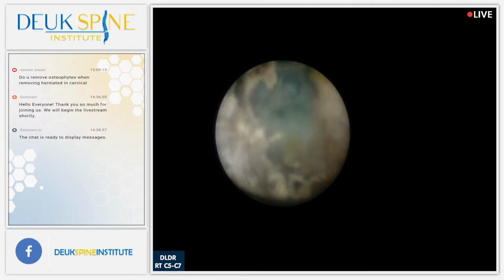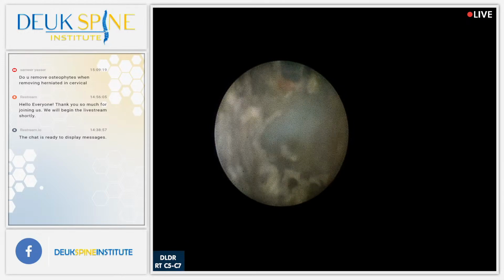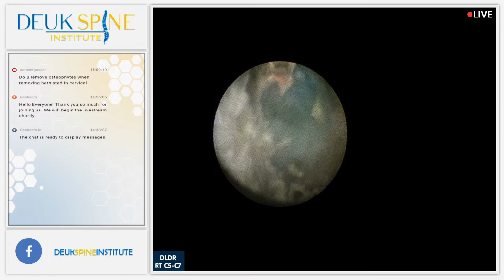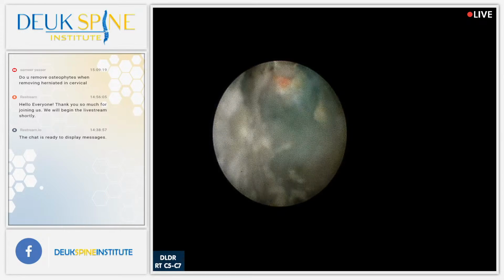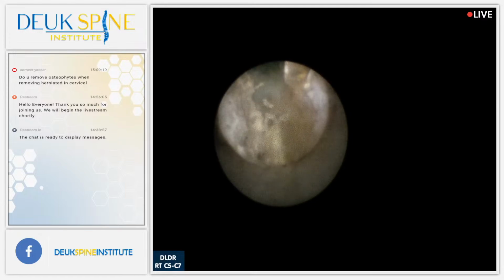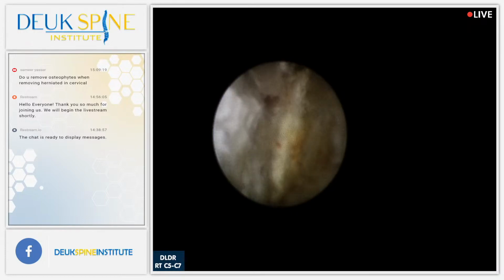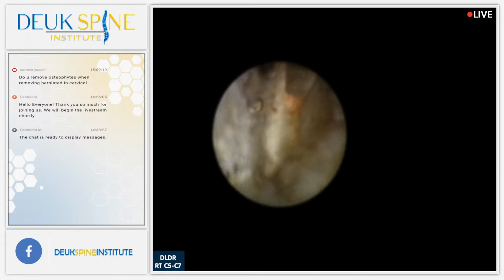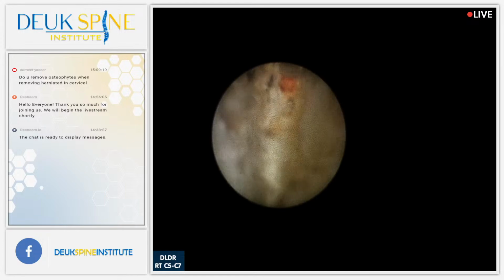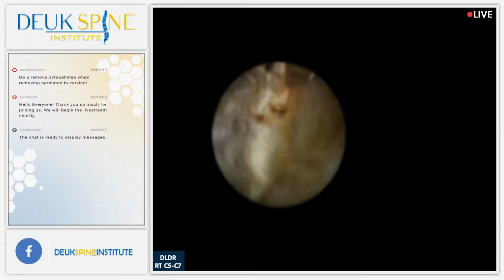A lot of, see the blue herniation here? Yes, we do. Little bone spur there. I got most of that already. Pretty happy with this side. I don't see any more herniation. Gotten rid of a lot of the bone spur. Some of this is going to be not possible to remove safely because it's resting on the spinal cord, and we can't take everything off of the spinal cord.